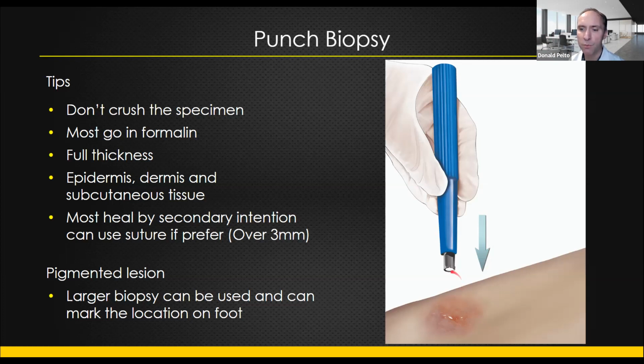Biggest frustration with this is the darn thing gets stuck in there, and you have to get it out. So when I am injecting the patient with lidocaine with epi, I save that needle in case I need to kind of hollow it out and get that.